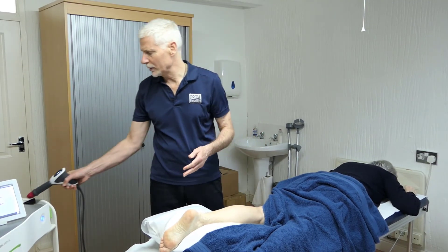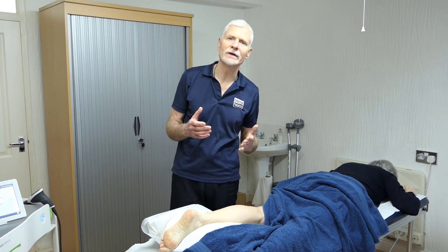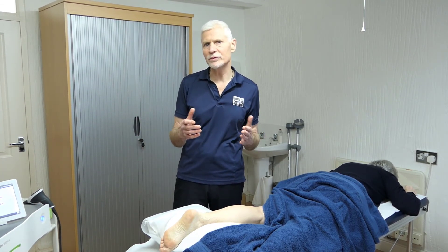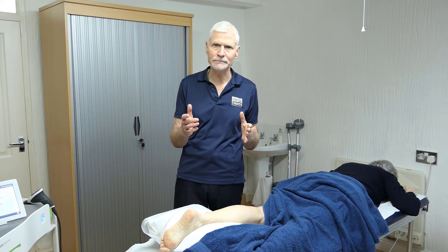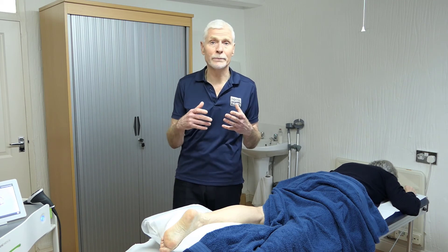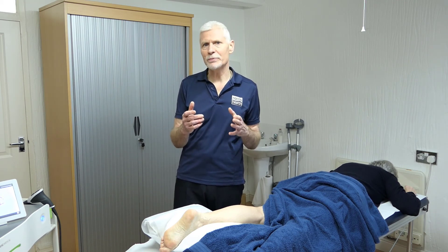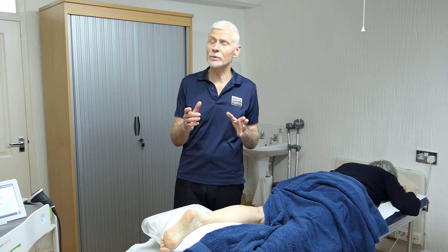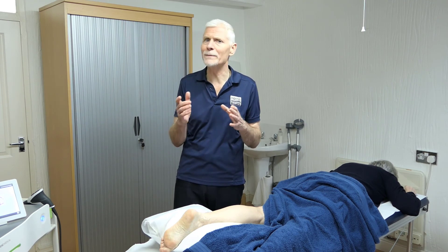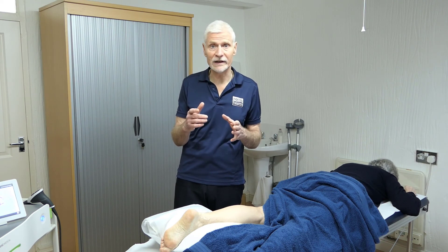The total treatment will be approximately 10 minutes, with perhaps 2,000 pulse shockwaves in total. That leaves the Achilles prepared in terms of physiology and pain relief, and we would then do our rehabilitation. Depending on the type of condition, we may do rehabilitation before or afterwards, but we wouldn't just use the shockwave in isolation.